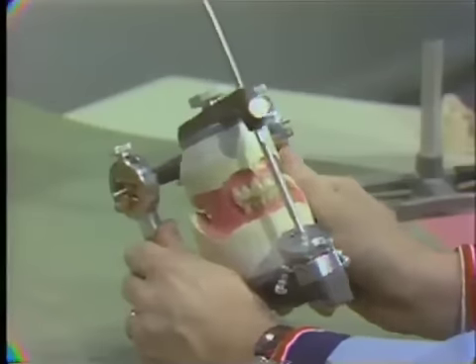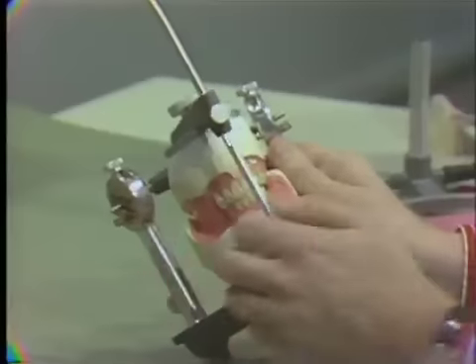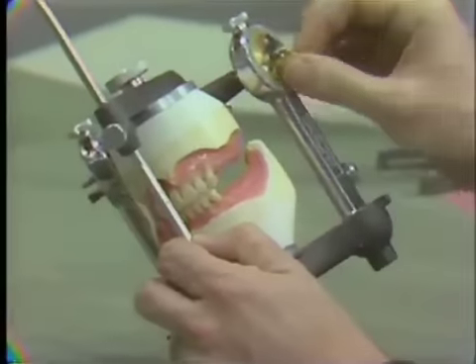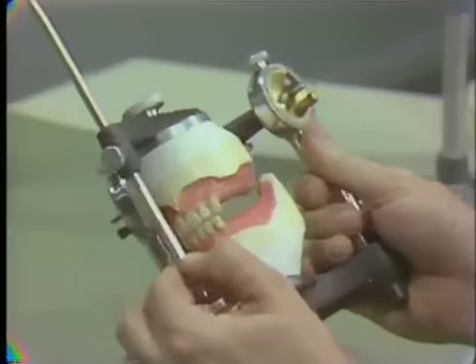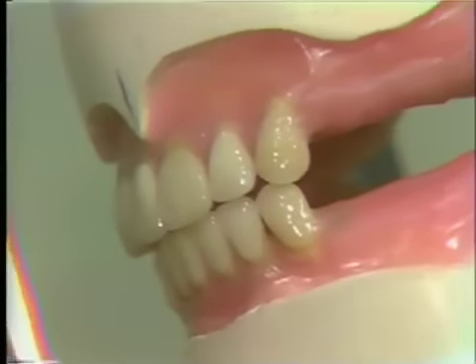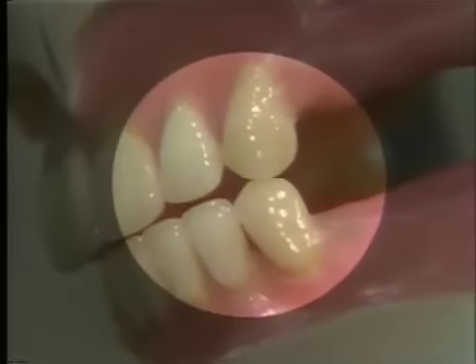What I'm going to demonstrate is setting the anterior teeth, which takes a minimum amount of work, and then the posterior teeth in a way that the teeth will balance. I'm starting at a point where the 12 anterior teeth have been set in the method that was described before. For the first time we're going to move the instrument as the patient would move his jaw into lateral excursions, and we can see right away that we have some interference in the cuspid area. As I move the jaw toward you — toward the screen — this is the working side. The mandible is coming toward us and the cuspid hits a little prematurely and brings the entire mandible out of articulation. See the centrals lift up there a little bit?